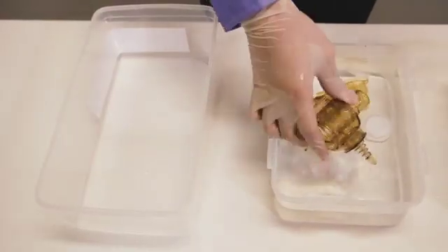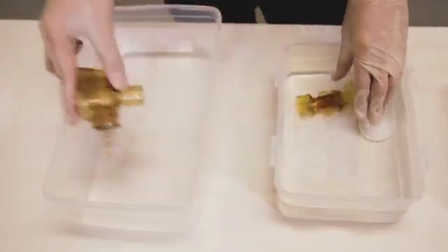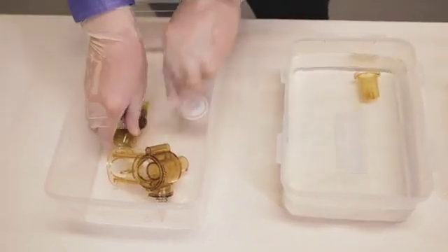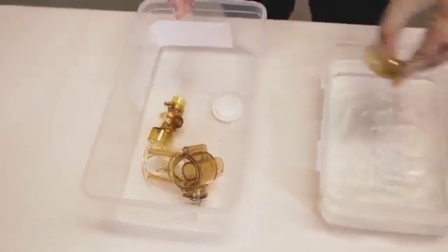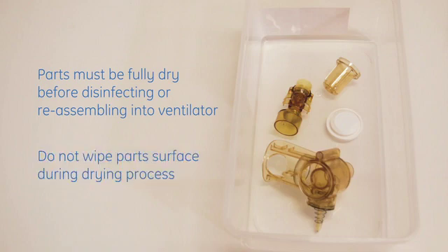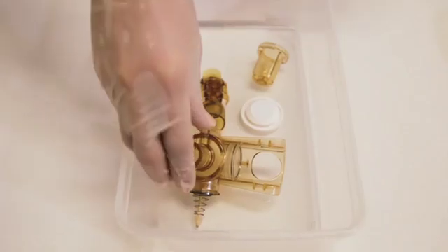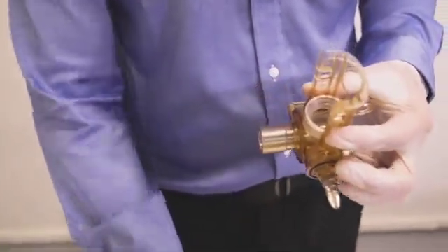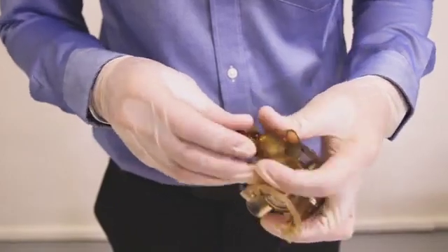After 2 minutes, remove the parts from the solution and allow the cavities to drain and dry in room air. Parts must be fully dry before disinfecting or reassembling into the ventilator. Do not wipe parts surfaces during the drying process. Check the parts for deterioration such as deformation or cracking.